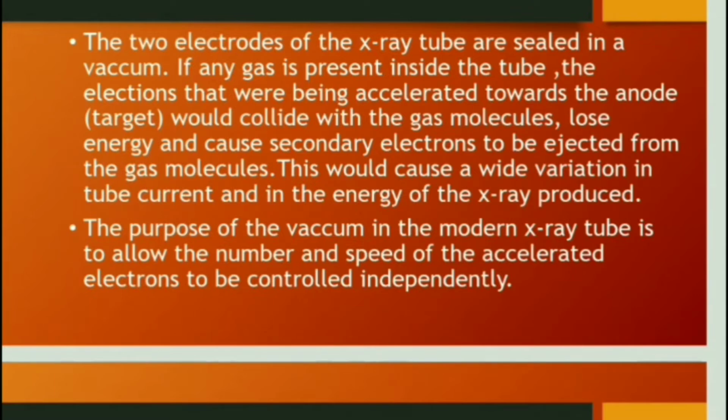So what is the purpose of the vacuum in modern X-ray tubes? It is to control the number and the speed of the accelerated electrons.